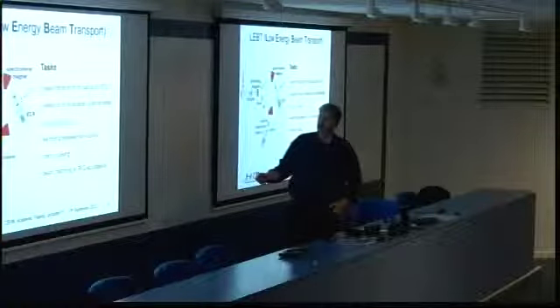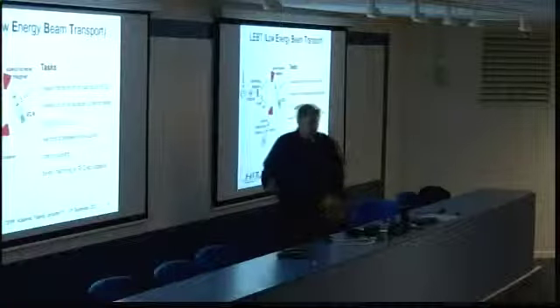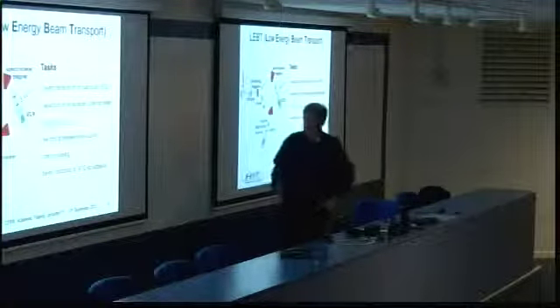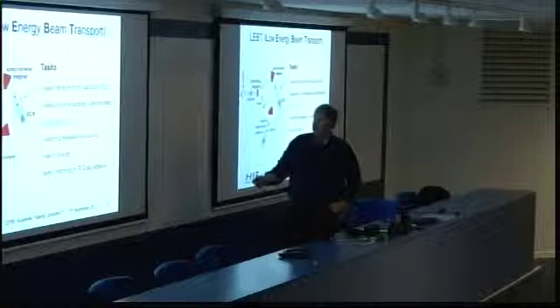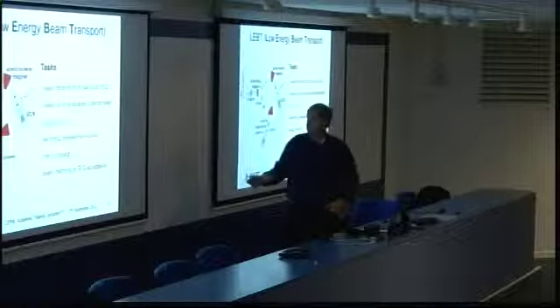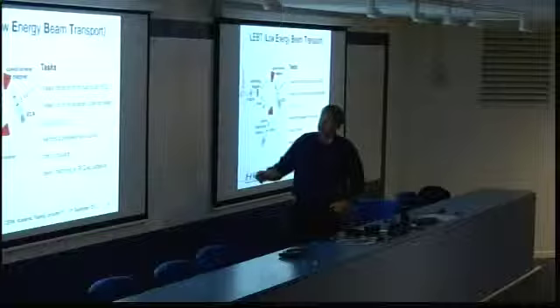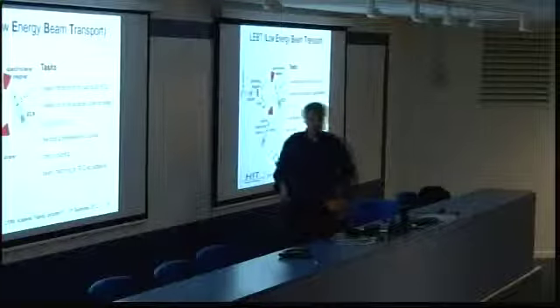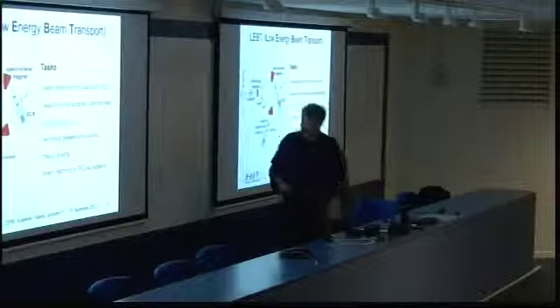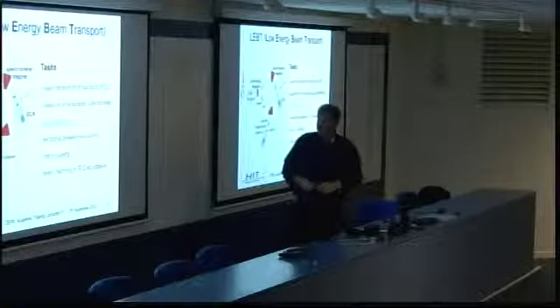Clearly, there are also some beam losses here along the beam path. But we do that all at 8 keV, so there is no radiation problem or something like that. So we can do that. Okay, then we need the switching between the two ion sources. And clearly then we need, because we go to cavity structures, a chopper to bring out a short beam pulse, as the ECR ion sources work DC.